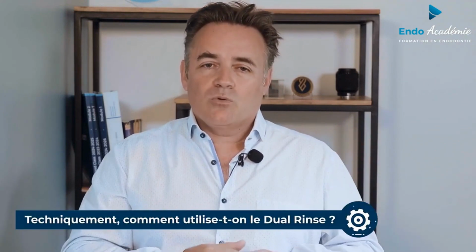Technically, how is Dual Rinse used? Dual Rinse comes in the form of a white powder contained in a typical medication capsule. Each capsule contains 900 mg of powder that will be diluted in 10 ml of a sodium hypochlorite solution. The dissolution is not instantaneous and may take 4 to 5 minutes.